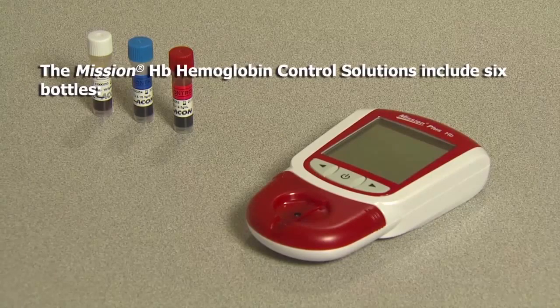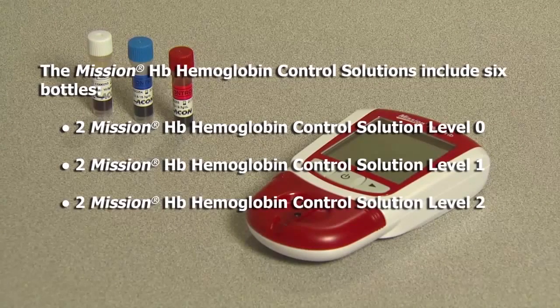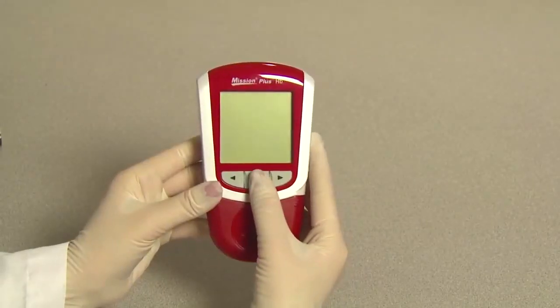The Mission HB hemoglobin control solutions include 6 bottles: 2 Mission HB hemoglobin control solution level 0, 2 level 1, and 2 level 2. Allow all test materials to reach a temperature between 59 to 86 degrees Fahrenheit or 15 to 30 degrees Celsius prior to testing. Invert the control solution bottle back and forth. Turn on the meter.